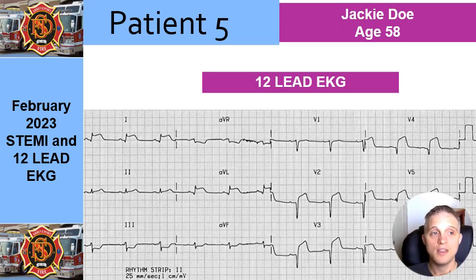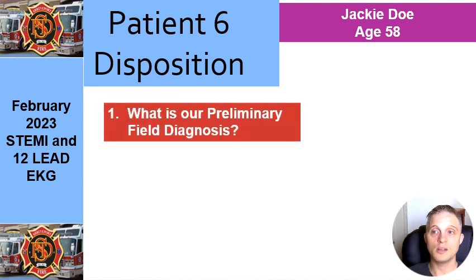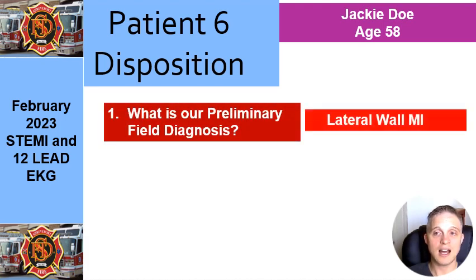Depends on where that clot is at. Depends on where that occlusion is. So what is the preliminary field diagnosis? Is the lateral wall, anterior lateral? You're not wrong if you say either one.